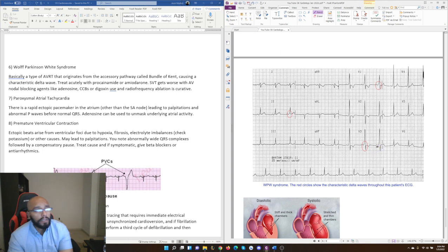So there's not going to be enough time to fill the ventricles, and that often ends up causing some level of palpitations and syncope and weakness. The other notable feature here is that V1 is actually pointing up when it should be pointing down. Right? So that's not good. V1 should be pointing down. aVR and V1 should both be pointing down. It's not. aVL should be pointing up. It's pointing down.